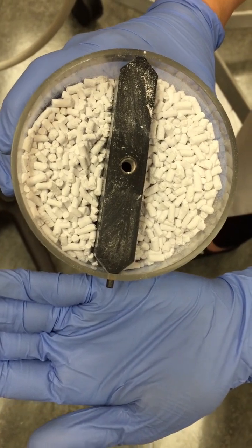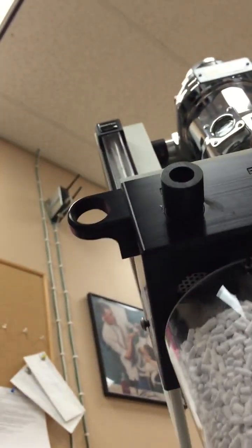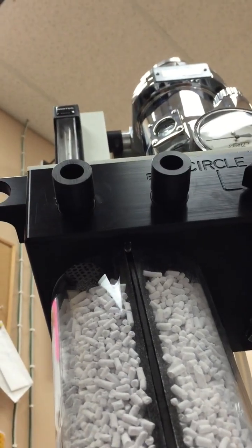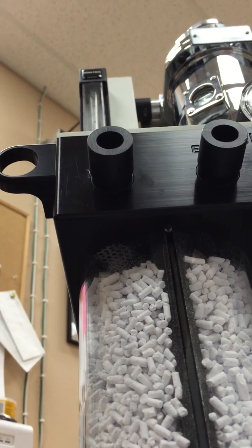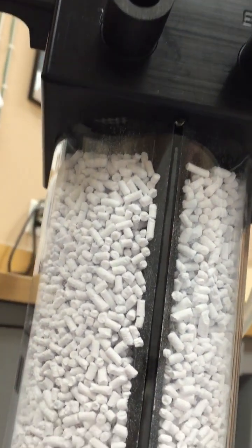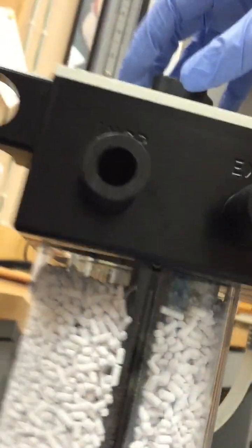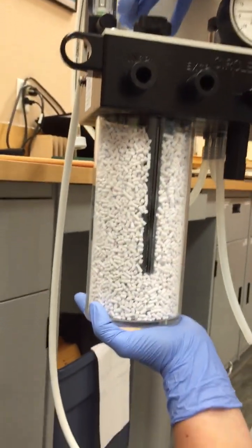Now, if you look at the top of this canister, you'll notice that there's a little notch right here at the front. You have to be aware of that because when you put it in, you have to line up the screw with the screw hole, and you have to fit this little notch right up into the machine. It's the only way that it will fit in. If you put it in off center and with the notch not in the correct spot, what will happen is you'll have an enormous leak in your anesthetic system.